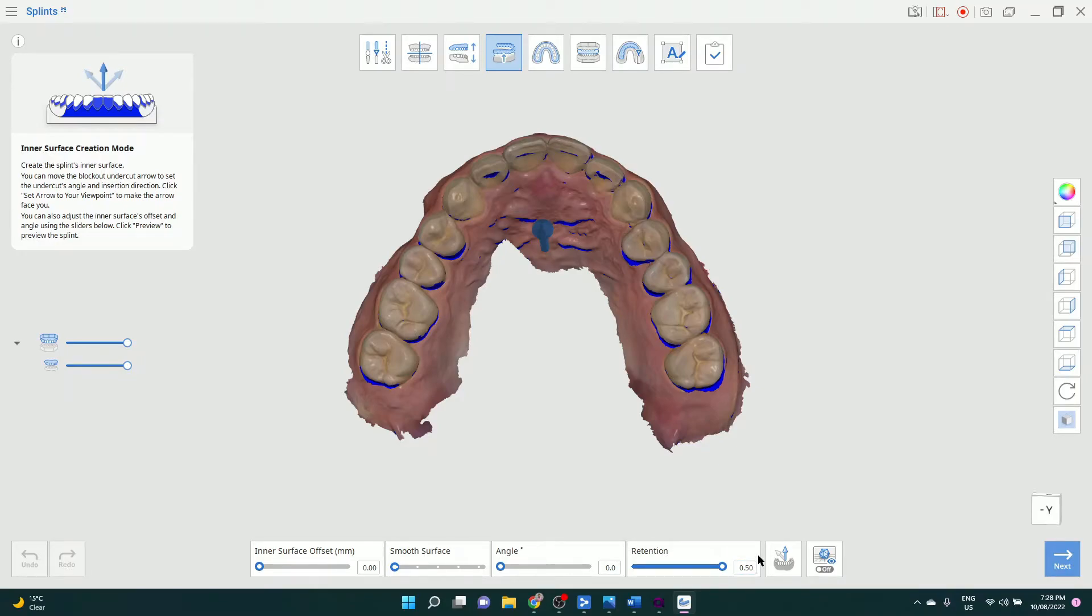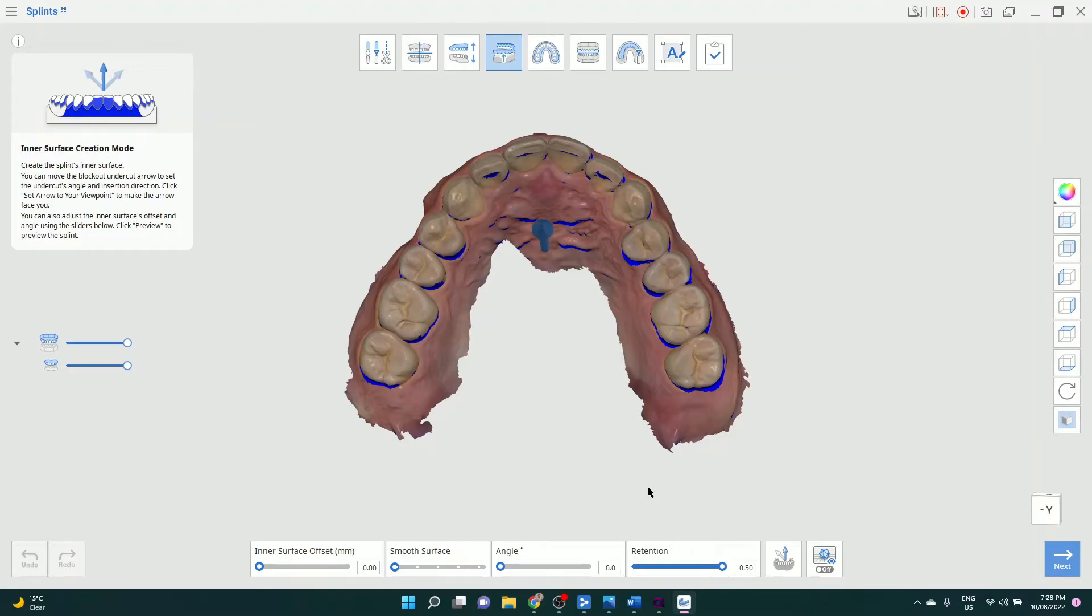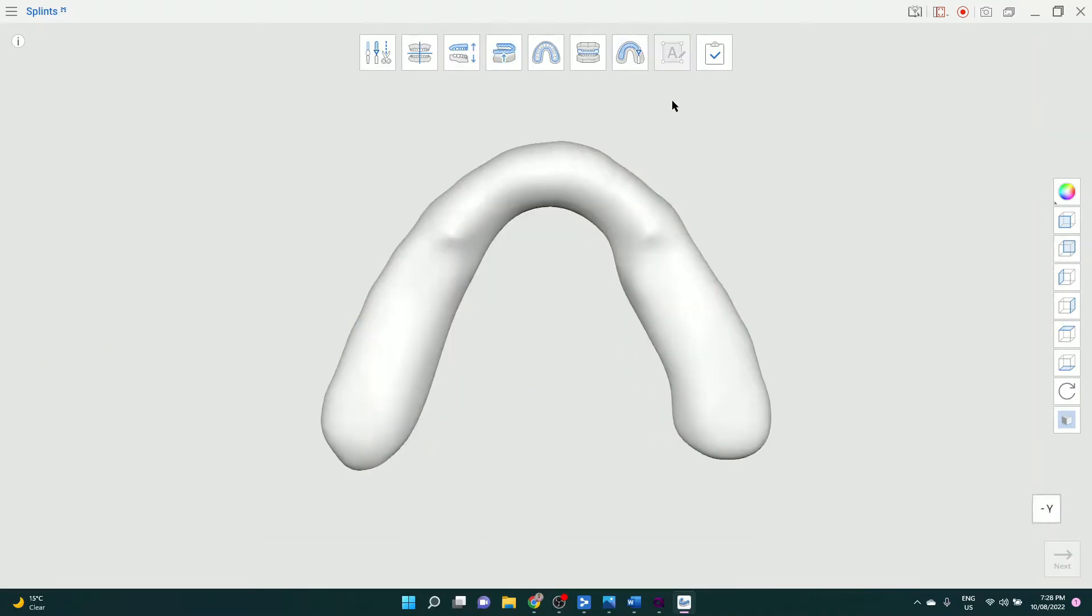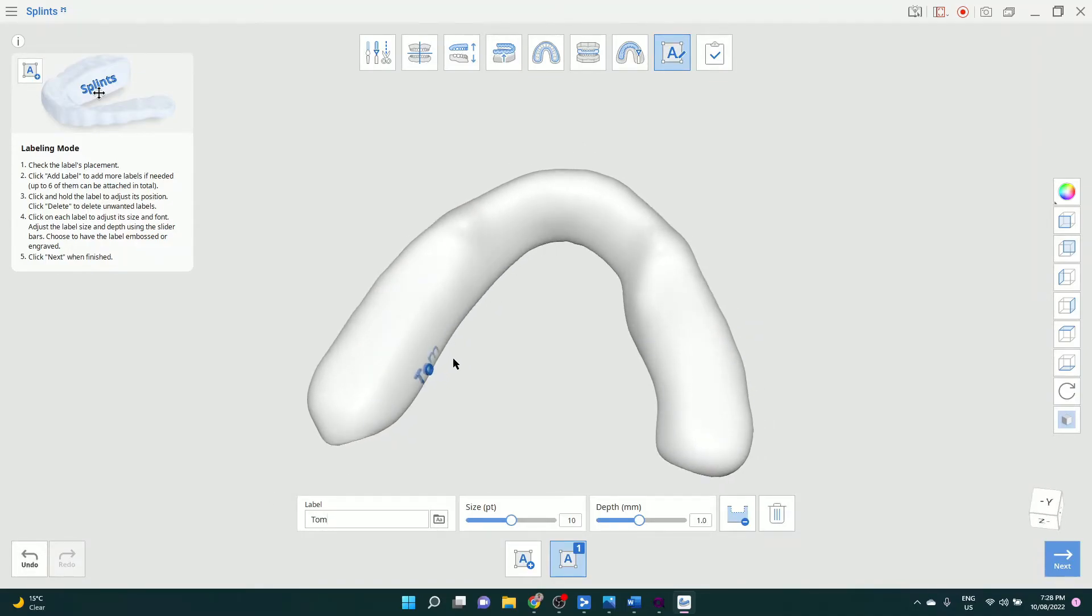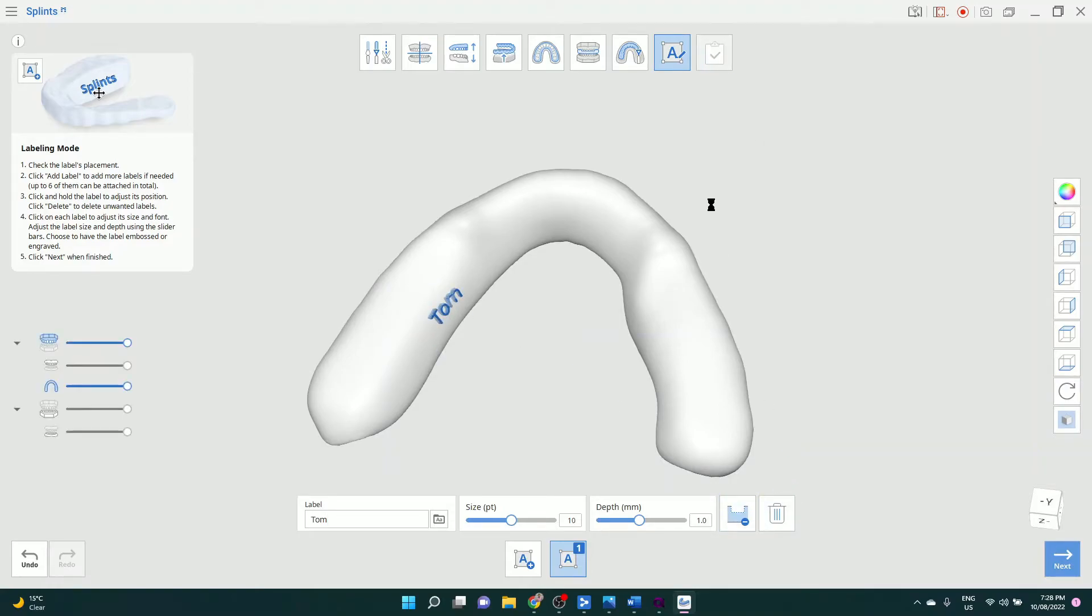So tomorrow's software release, you'll be able to go up to 1.0, but I found 0.5 to work really well. So I'm printing on an Anycubic, Keystone Keysplint Soft. You can add a label if you like. Then you're done.